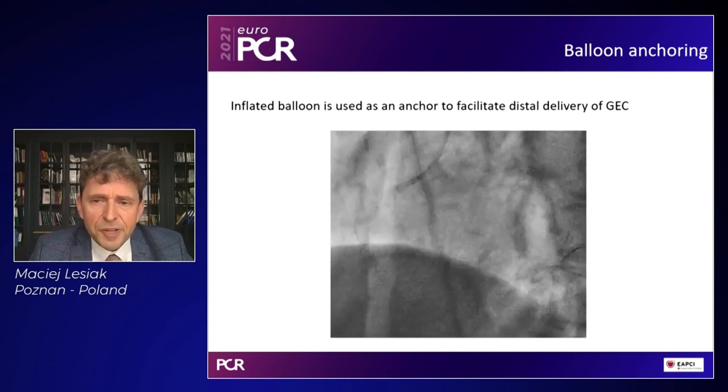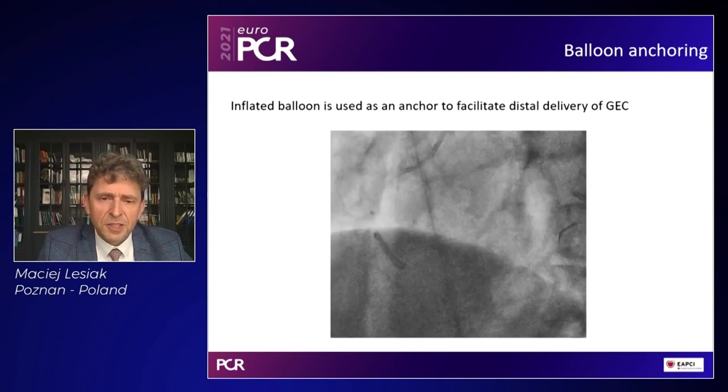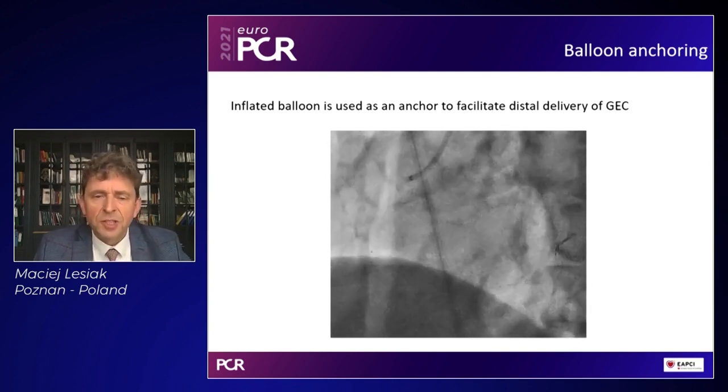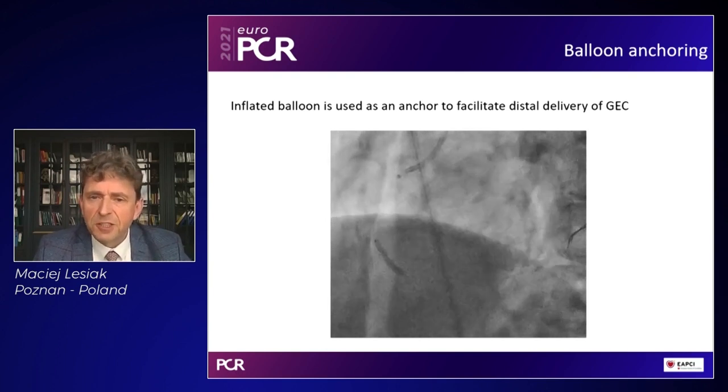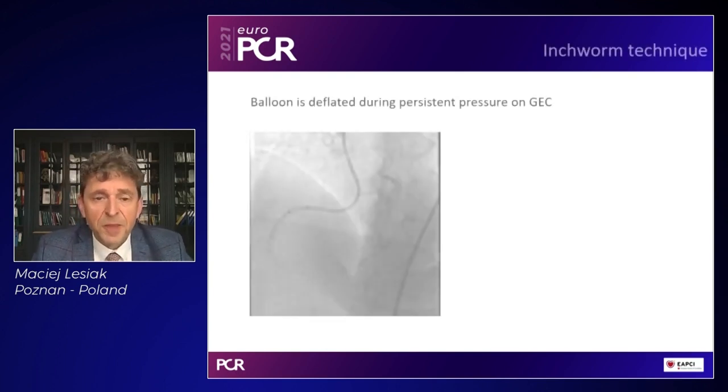A balloon anchoring, so you inflate a balloon distally in the distal part of the vessel, and once you inflate it, you use it as an anchor to facilitate distal delivery of a guide extension catheter.